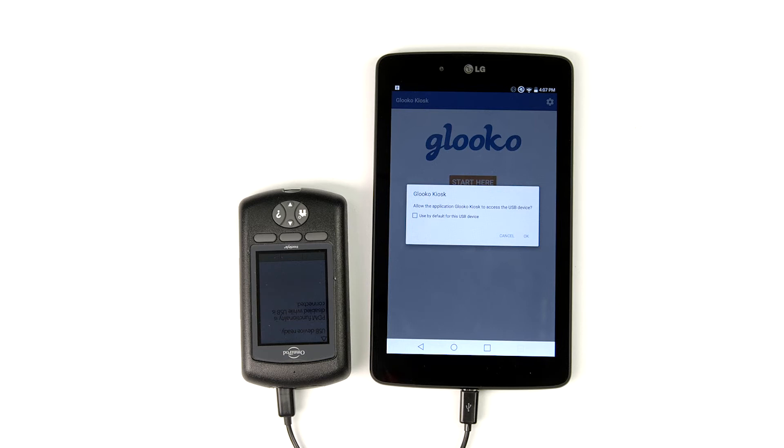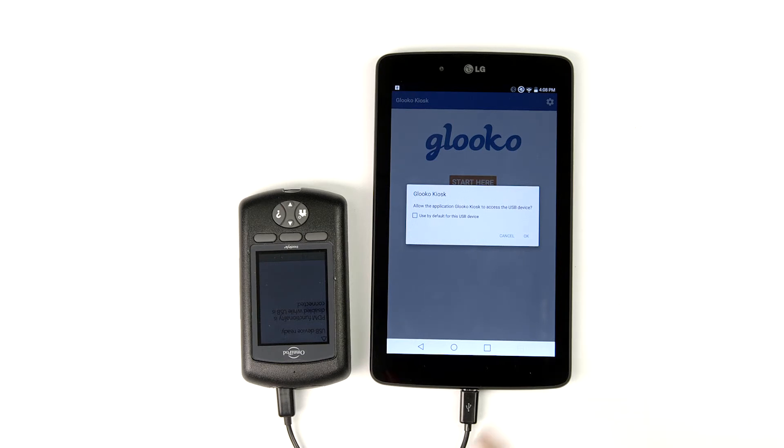Since Kiosk needs access to the data file via USB connection, you'll see a pop-up requesting that permission. Tap OK to allow access.